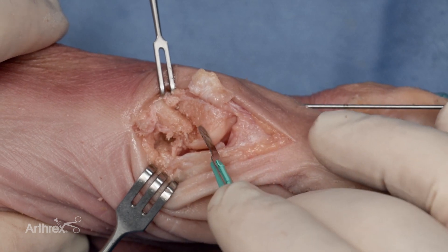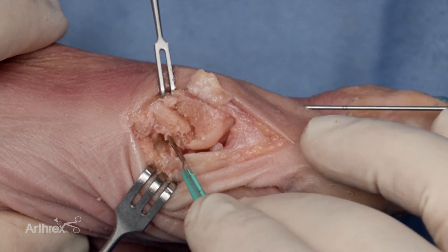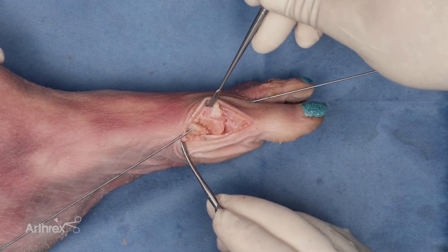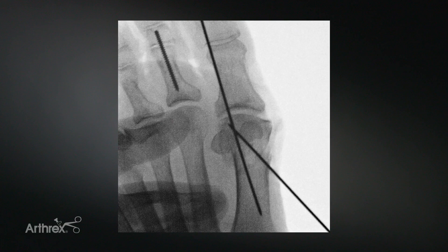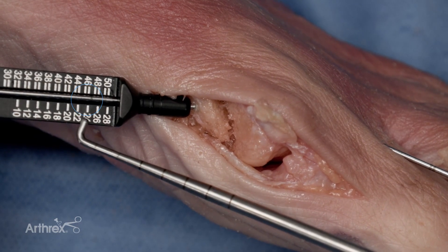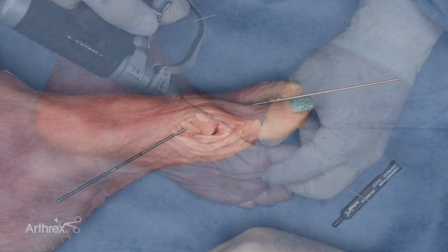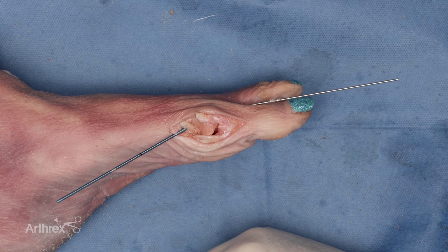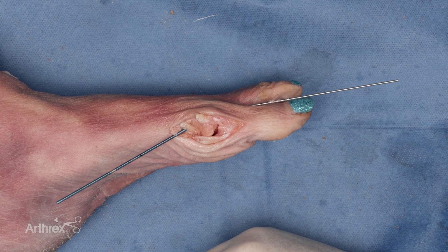Provisional fixation with a K-wire is achieved. At this point, the residual medial eminence is maintained. A guide wire is placed across the osteotomy site. This can be confirmed radiographically. The depth gauge is then utilized; the reading on this is 24 millimeters. The 1.9 millimeter snap-off compression pin has been inserted. This provides not only compression but solid fixation of the osteotomy site.